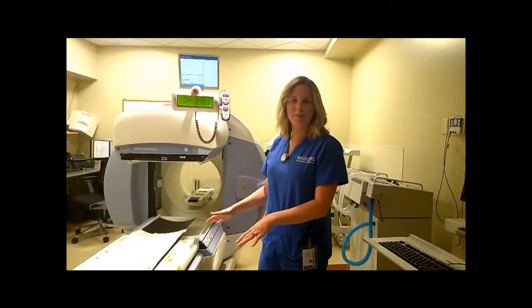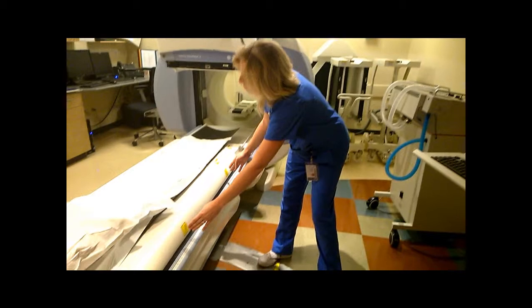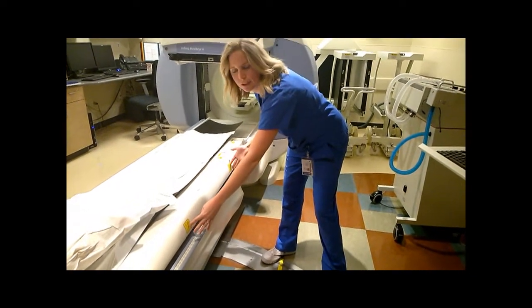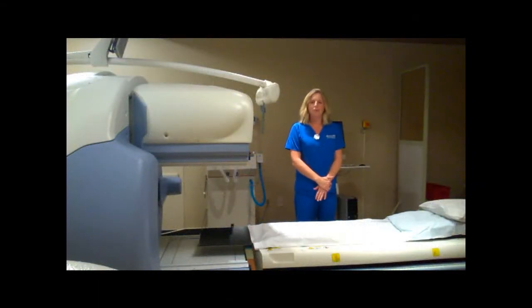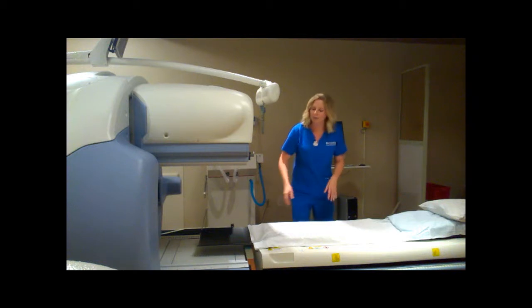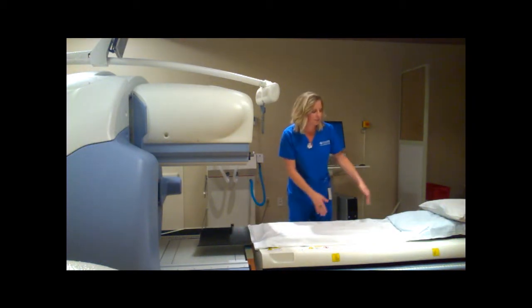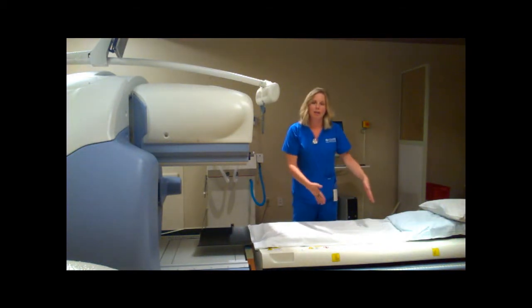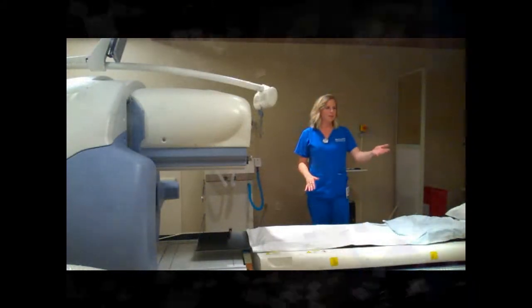When you're going to put your patient on the table, you want to make sure that whatever anatomy you're looking at is between these yellow lines here on the table, because those are the limits for the CT on this machine. Now I'm actually going to put a patient on the table. I've already put my table extender here on the bottom, and that's because we're going to have our patient kind of low on the table.